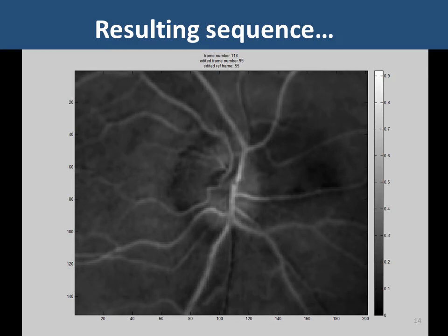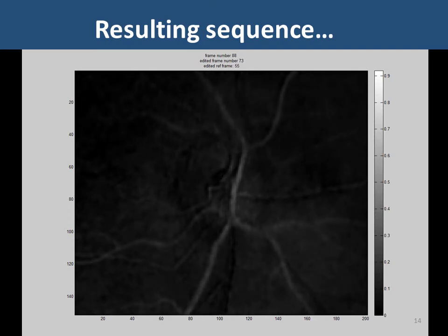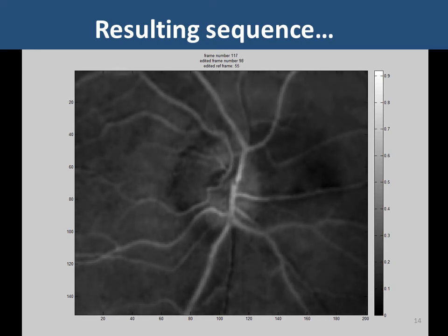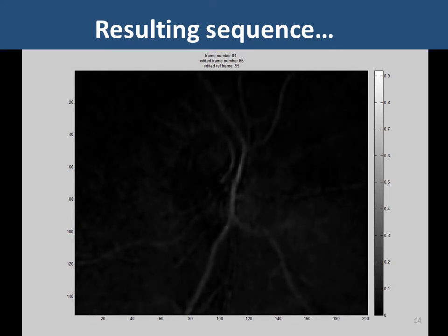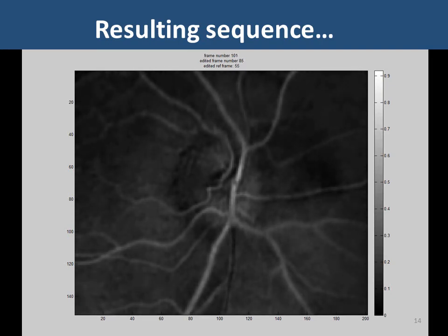That's probably as dim as they go. So what you see is arteries filling first as this deoxygenated blood goes through. Actually, this is reoxygenated blood returning to the retina. So it's going from deoxygenated to oxygenated. But you see the arteries filling first, and then, so this artery here, you see some smaller vessels starting to fill up. This vein here remains dark with a branching vein coming in from the side, partially filling.